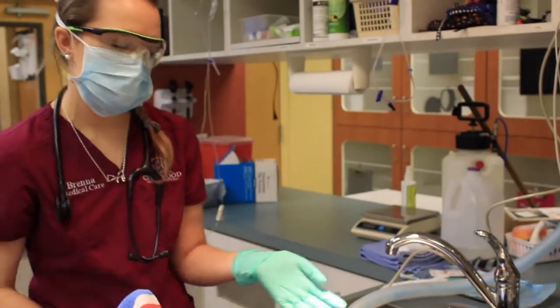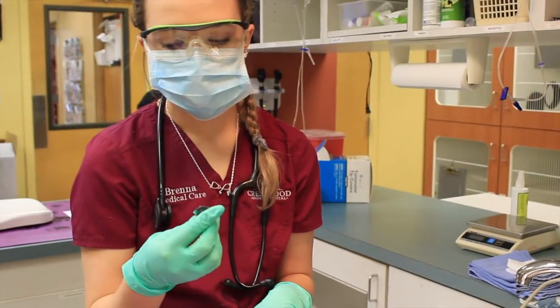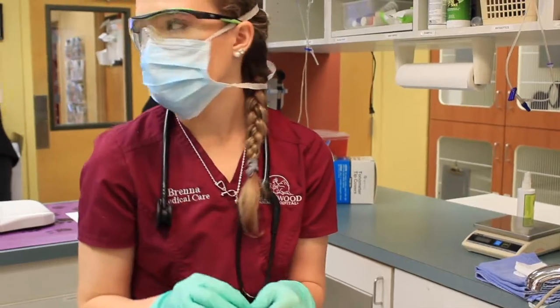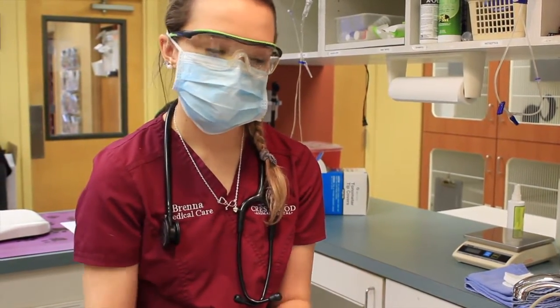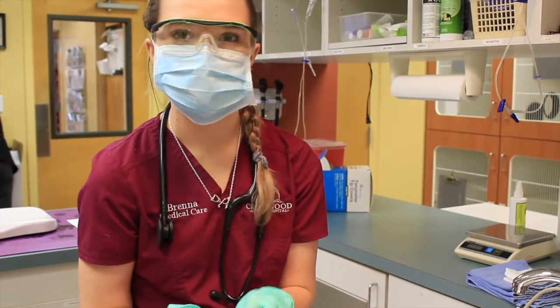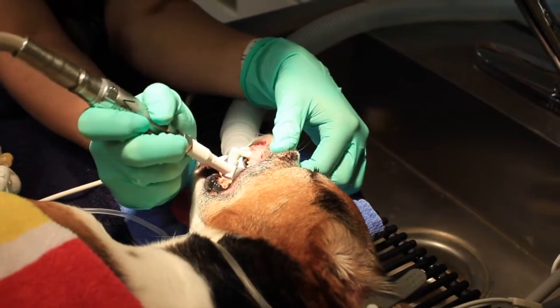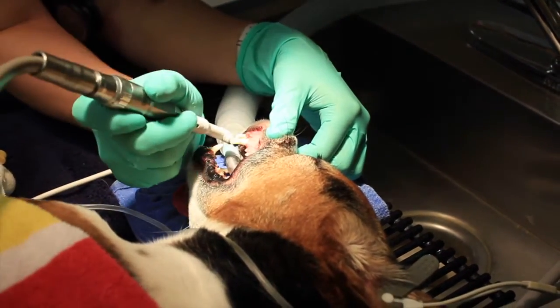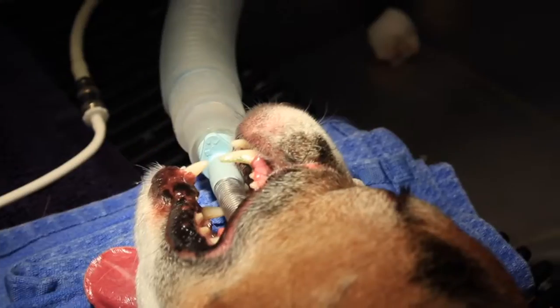Now that we've looked at all the teeth and scaled them, I'm going to polish. This is a mint flora toothpaste — it's kind of gritty and it's going to go through and polish every tooth so that any abrasion or defect is smoothed out, which means bacteria will stick to it less readily. One tooth down, half a mouth to go. Then we're going to flip her over, feet under, and start the whole process all over again on the other side of the mouth.